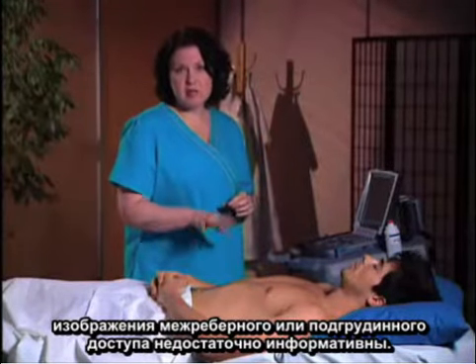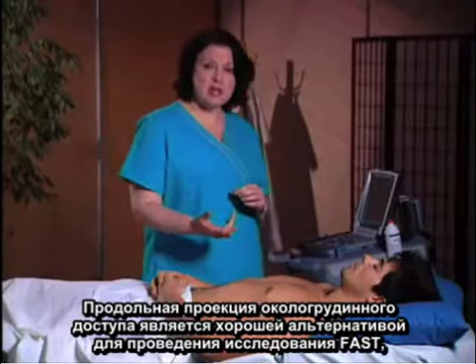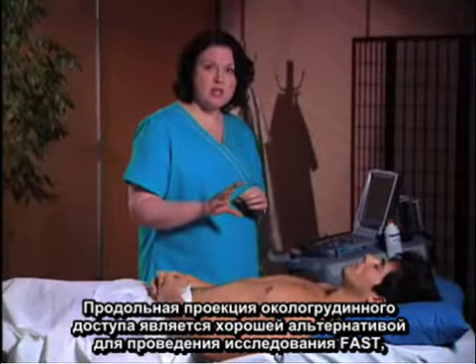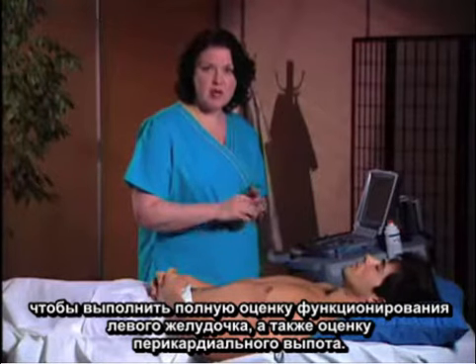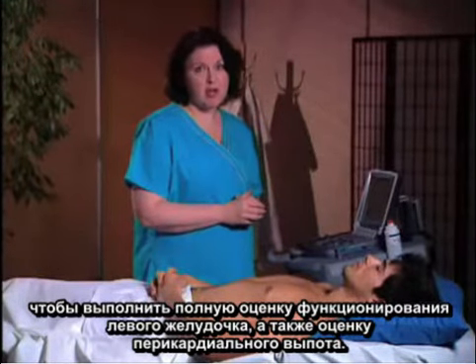The parasternal long axis you can also use as part of your FAST examination if you're having trouble doing the subcostal or subxiphoid view. The parasternal long axis is a great alternative to get an overall estimation of function of the left ventricle as part of the FAST exam, and also evaluate for pericardial effusion.